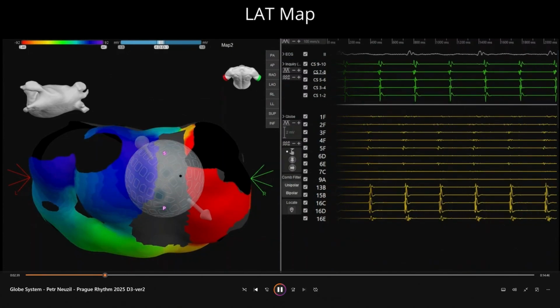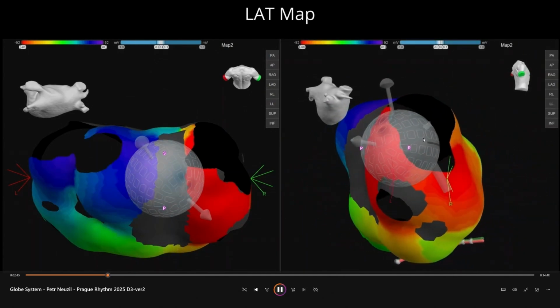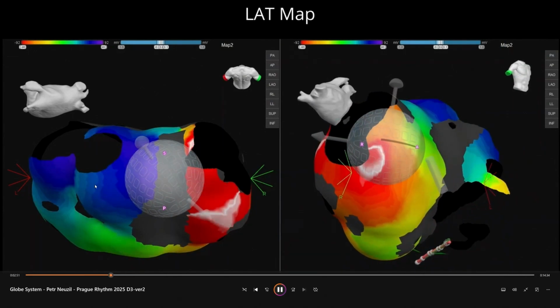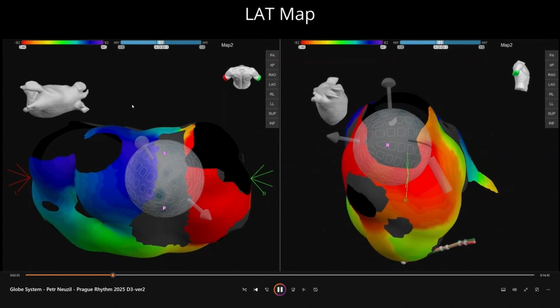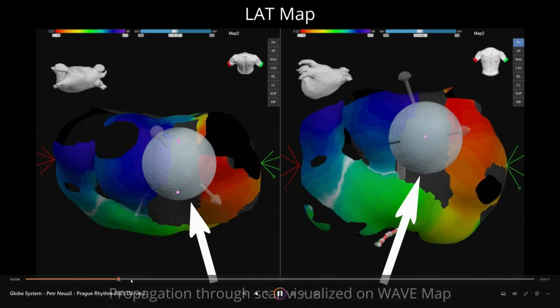This is an activation map now, and you can see this activation during this running arrhythmia. You can see that the catheter is really able to give you a lot of information, because of the 122 electrodes on that surface. Okay, so let's proceed more.